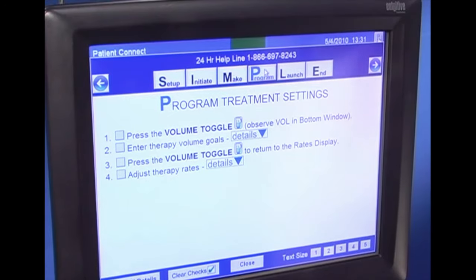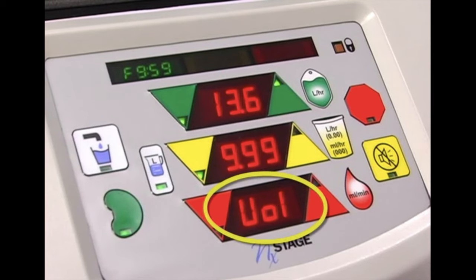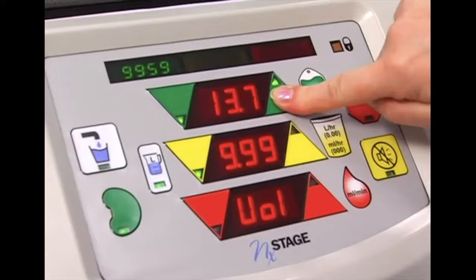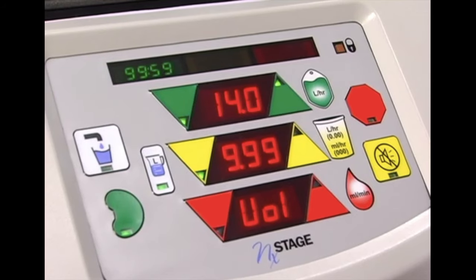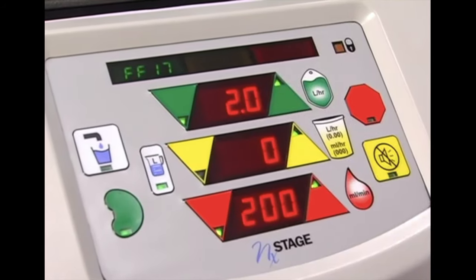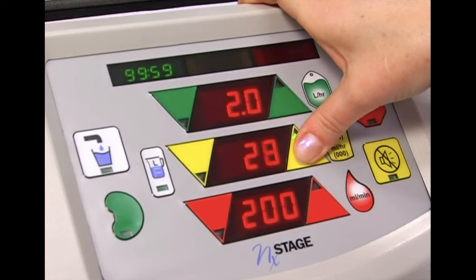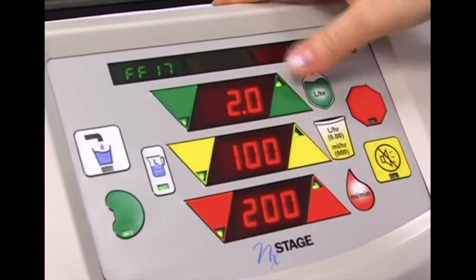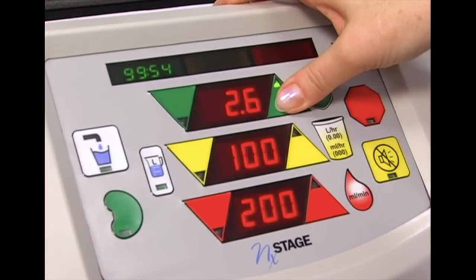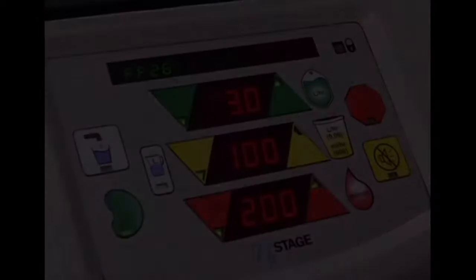Click the program button to program your treatment settings. Press the volume toggle and observe VOL in the bottom window. Enter the therapy volume goals, making sure you see VOL in the red window when entering volumes. Press the volume toggle to return to the rates display, or the rate display will reappear if buttons are not engaged for 10 seconds. Adjust your therapy rates. This completes the section on programming your treatment settings.